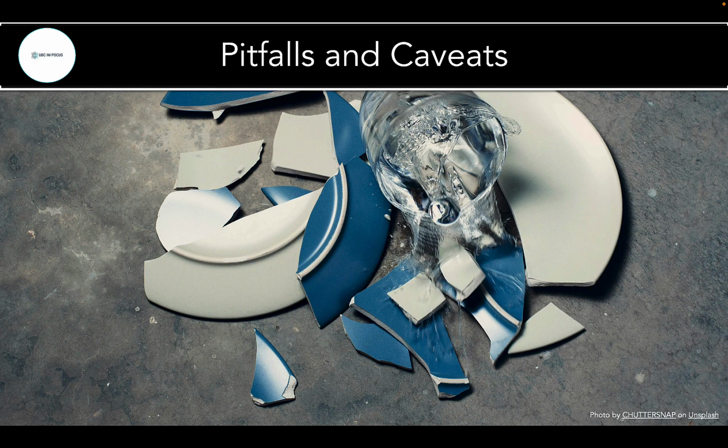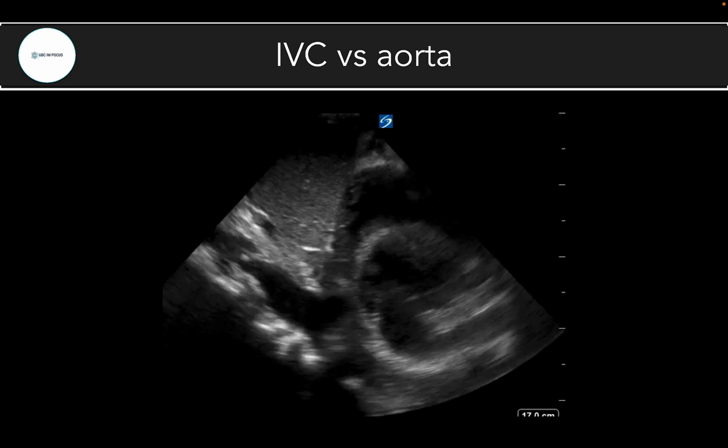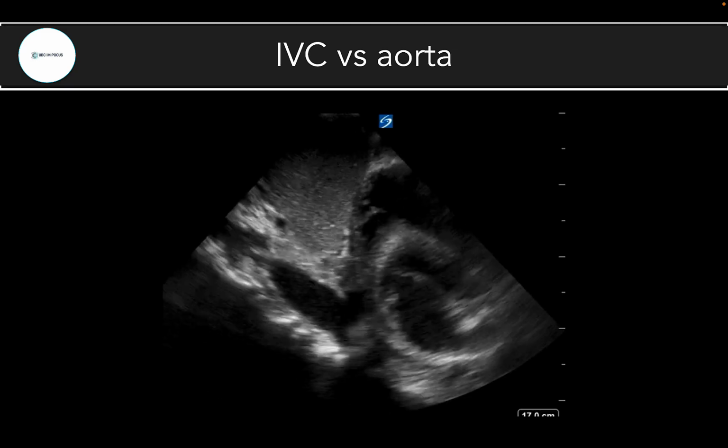All right, lastly, let's touch on a few common pitfalls and caveats with IVC scanning. First is the classic IVC versus aorta. So we've all mistaken an aorta for an IVC at least once.